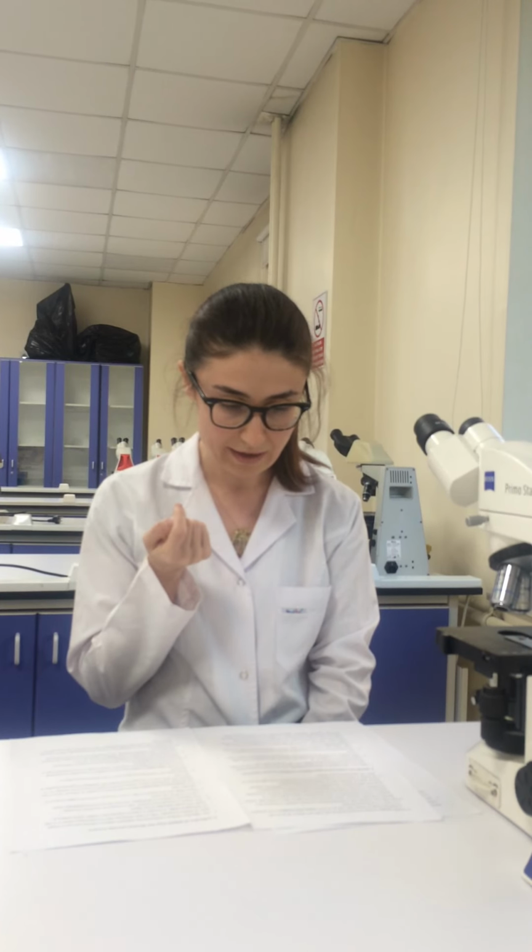at a density of 60,000 cells per square centimeter on the desired size of culture dish or plate with culture medium containing DMEM/F12, 10% fetal bovine serum, and 1% antibiotics of penicillin, streptomycin, and amphotericin B solution.